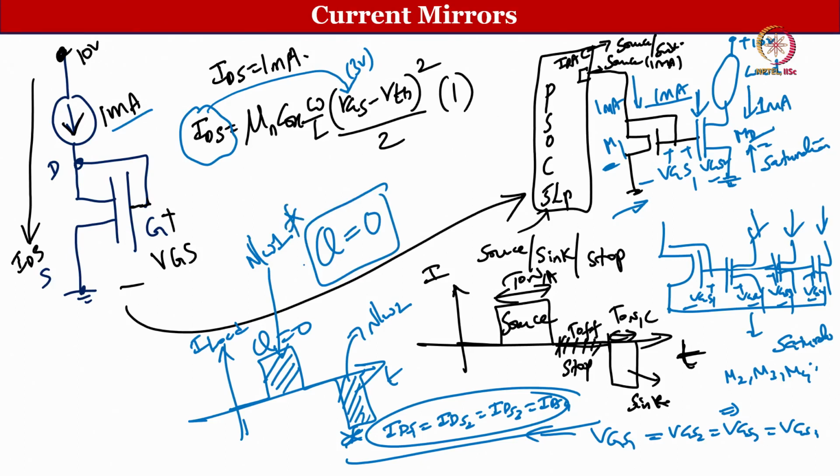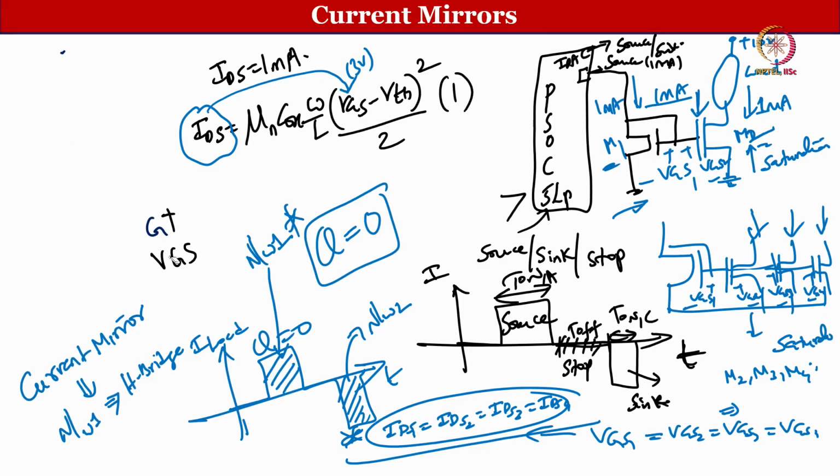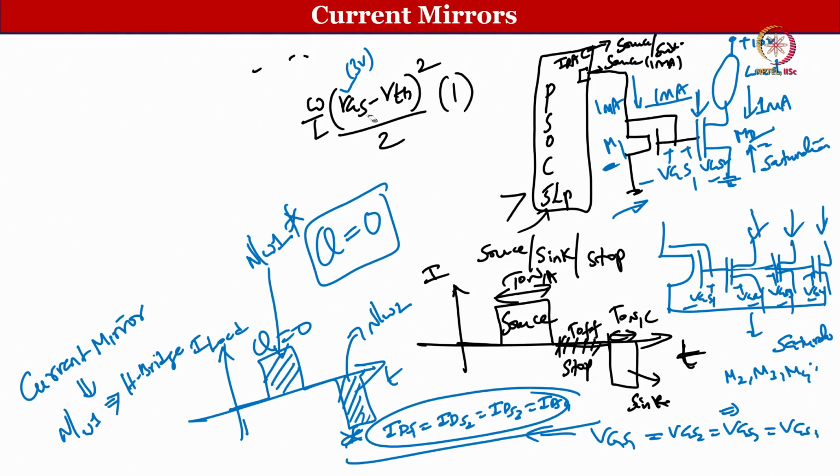So, what people can do generally is you have current mirror configuration, you take only network 1 and you connect the output in the H bridge manner, right. So, when I say H bridge, how does it look like is this. Because two networks are generating, no? One network is generating cathodal, one network is generating anodal pulse. That is where the problem is coming, because charge neutrality will never be maintained as 0. The important thing is the charge neutrality, right.